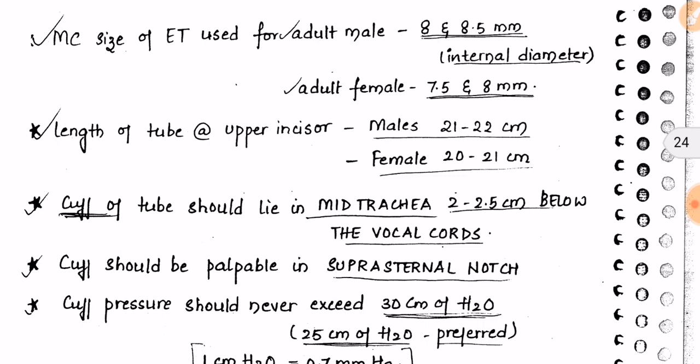To clarify: the size of the ET tube means the internal diameter — it does not mean the length of the tube. The cuff of the tube should lie in the mid-trachea, 2 to 2.5 centimeters below the vocal cords. Whenever you cross the vocal cords you feel some resistance, and then you push it 2 to 2.5 centimeters below.